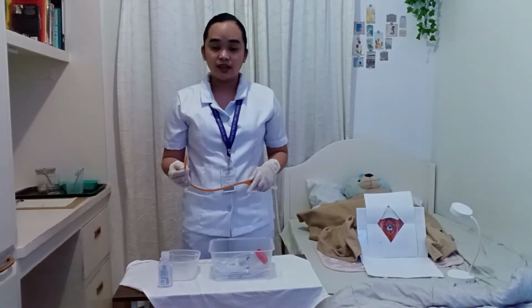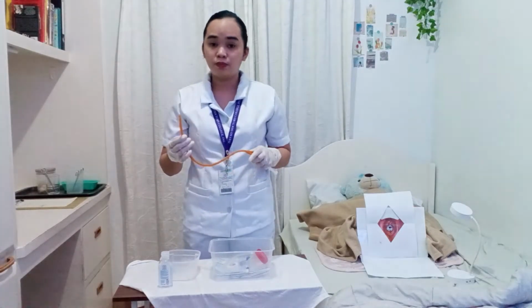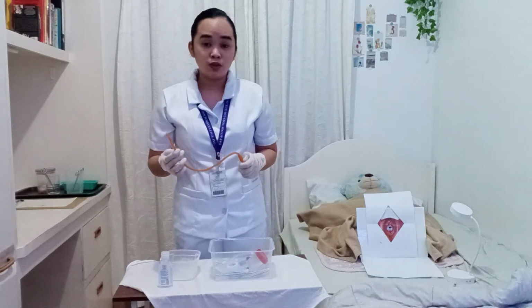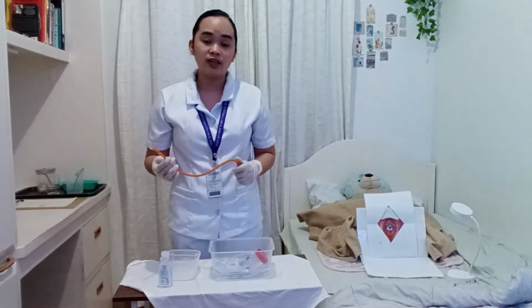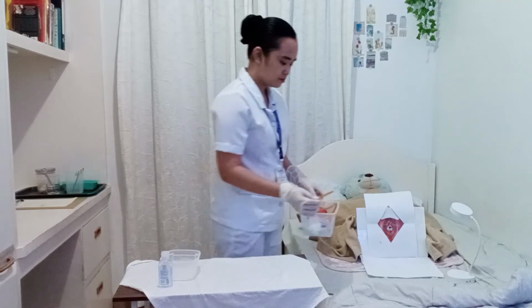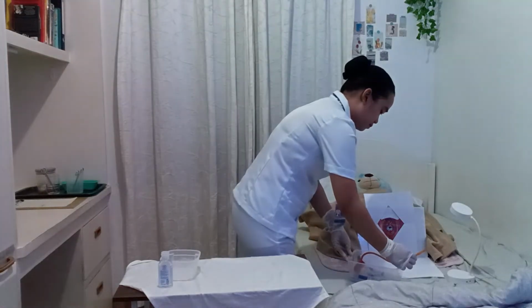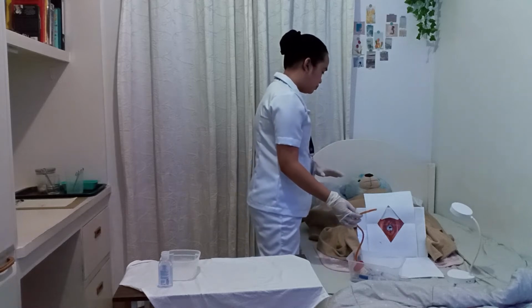So now pick up the catheter for about 3 inches from the tip with your thumb, just like this, and then place your thumb and fingers of your non-dominant hand between the labia minora while separating and pulling off the meatus gently, as this will provide visibility. Okay. So now, ma'am, I'm now going to touch your genital area, okay?